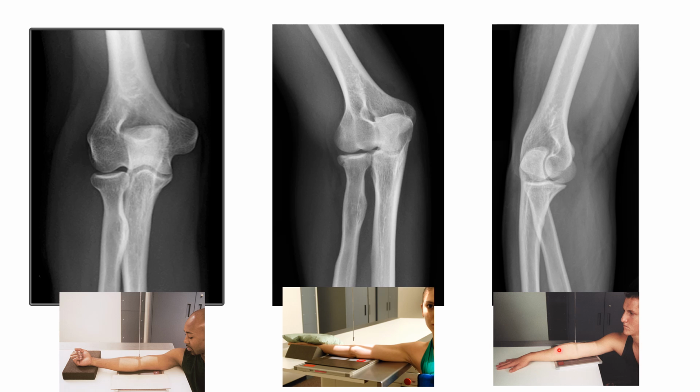Just like we see in this picture here, his arm is extended parallel with the IR, but instead of externally rotating the arm, he's internally rotating the arm. Thumb is going in toward the midline of the body. We're rotating the arm to make the interepicondylar line 45 degrees oblique from the IR. And this is the resultant image here.